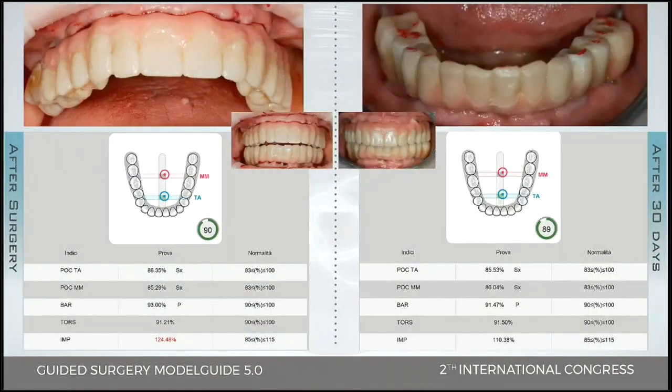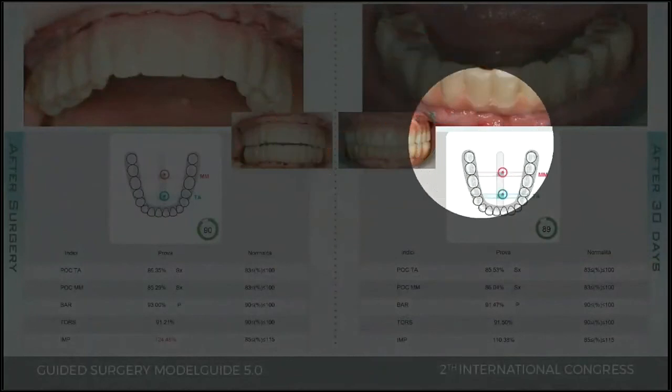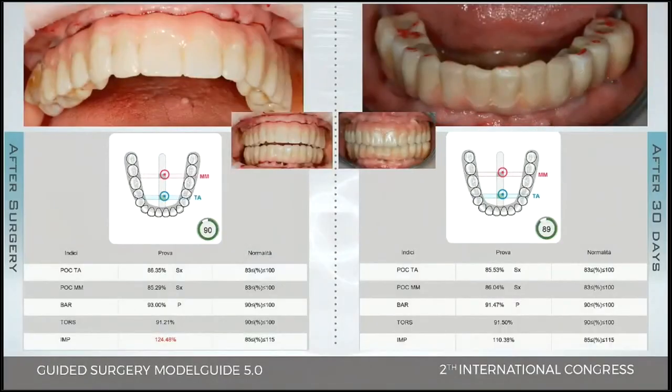It's absolutely mind-blowing. And this is after only 30 days, one month. Everything is perfect. The patient was good, no pain at all.